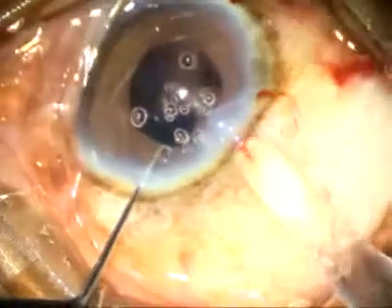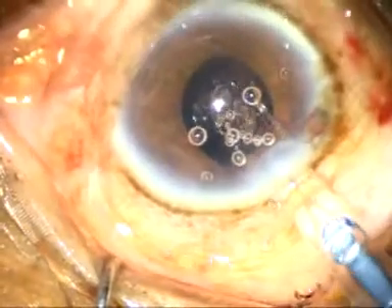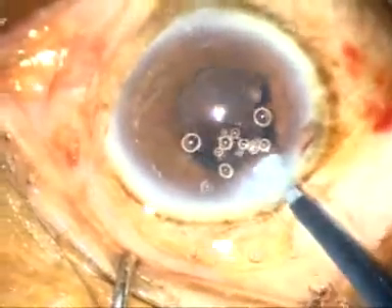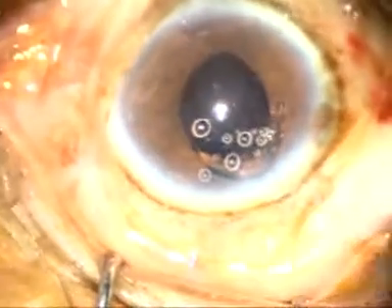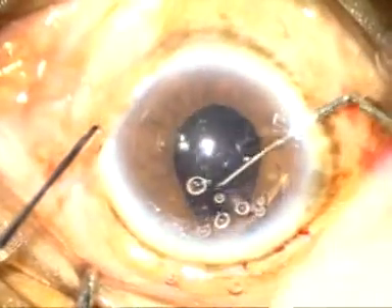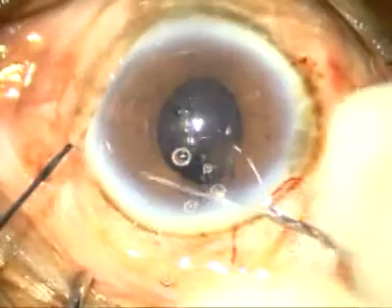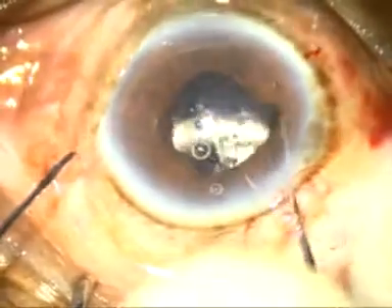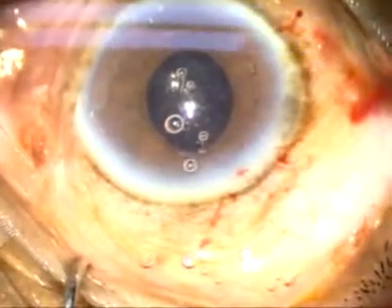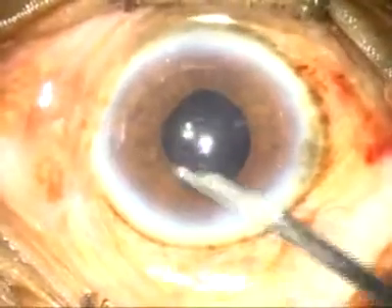I can nicely place the lens in the bag. I am observing the direction of the haptic — it should go into the bag. The trailing haptic will be dialed by the Sinski hook into the capsular bag. Now I am checking whether it is in the bag or not — yes, the lens is in the bag. With the Sinski hook, just retract the iris and check if the lens is in the bag; in this case it was in the capsular bag.